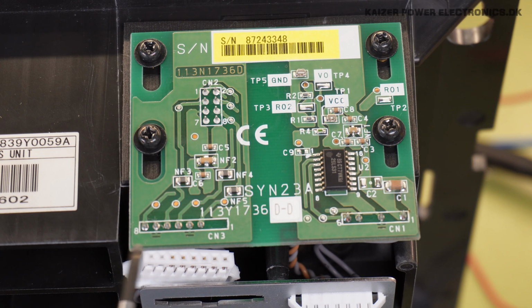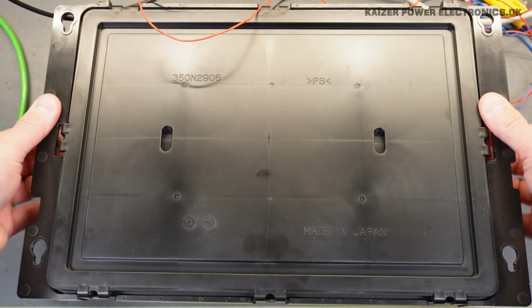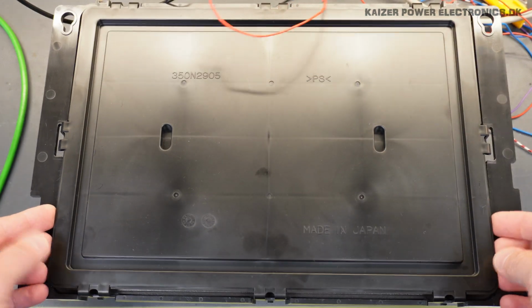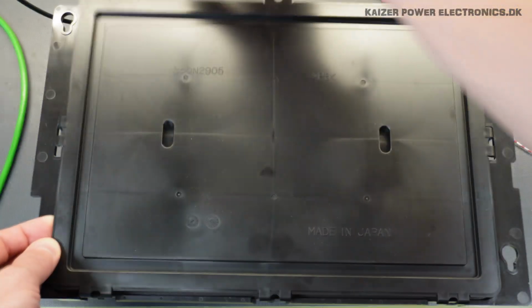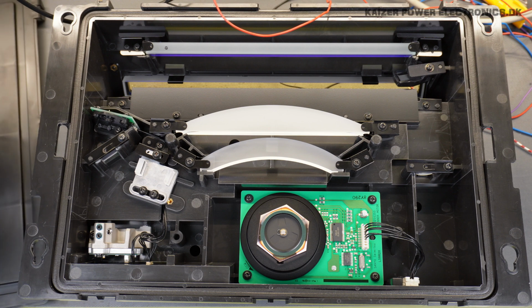The connector for the scanner motor is actually in two parts. The part on the right is a light feedback, which measures the reflected light inside the case, whereas this only has to do with the scanning motor itself. Now, I did find some service manuals with some schematics about this, but of course all the naming conventions of the different pins differ. The unit actually comes with a click-on lid, so it's quite easy to get into the whole unit. It just sits with a small gasket all around it, but it seems to be good enough to avoid getting any dust inside. I guess this was of course assembled in a clean room, which we are going to ruin now. Oh wow, look at that nice optics there.